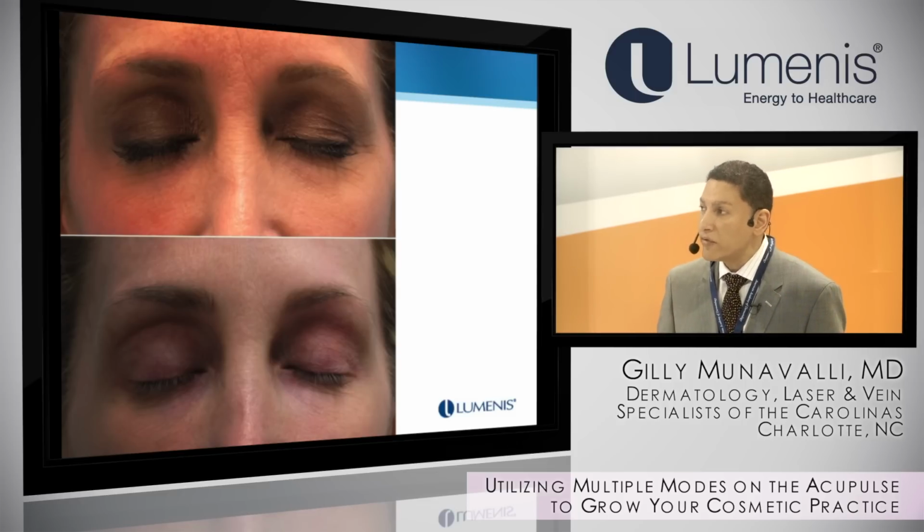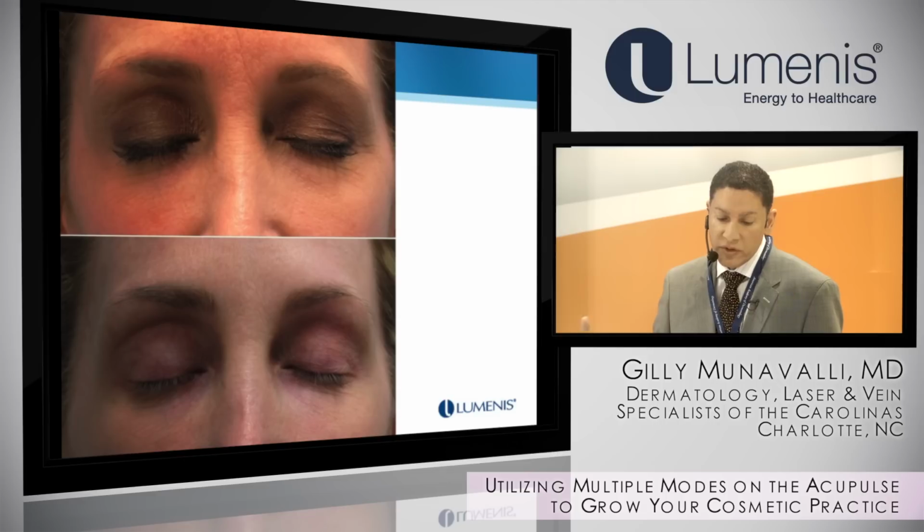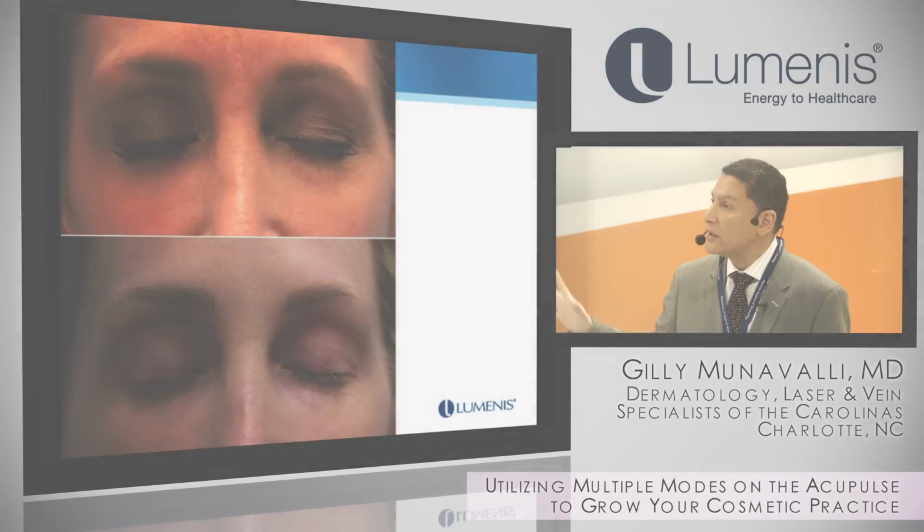Now, they do stay red for a lot longer. They'll stay red, erythematous, for probably 2 weeks as they fade along, and you have to use some topical steroids and so forth. And it's a little bit more sensitive, but that's the kind of improvement. And so I've almost switched to doing feather touch on these type of patients around the eyes before I do anything else.